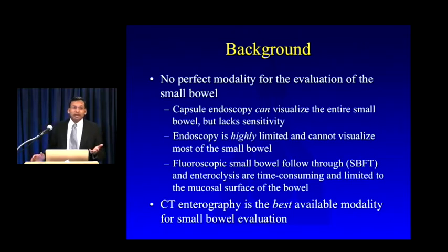Now, from a radiologic perspective, all of us have done fluoroscopic small bowel follow-throughs. Some of us have done enteroclysis. But I think we all recognize that this is a time-consuming modality. Increasingly, there are fewer and fewer of us who feel comfortable doing the studies well, and interpreting the studies is still a diagnostic challenge. On top of that, it is a fundamentally limited modality in that it's only going to show you the mucosal surface of the bowel, and it's really not going to give you much information about what else is going on in the abdomen and pelvis. So putting all of that together, I think there's very little doubt that today, at our current stage of evolution in radiology, CT enterography is the best available modality to evaluate the small bowel.